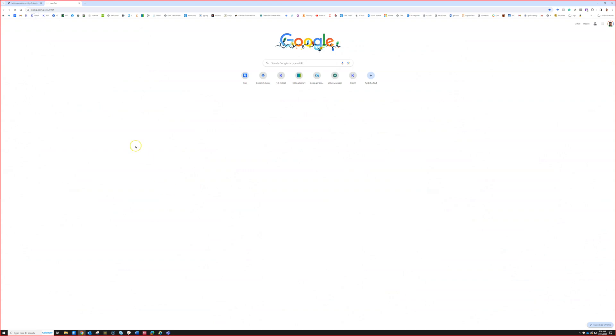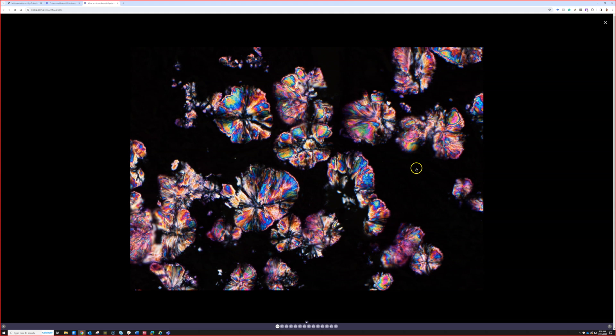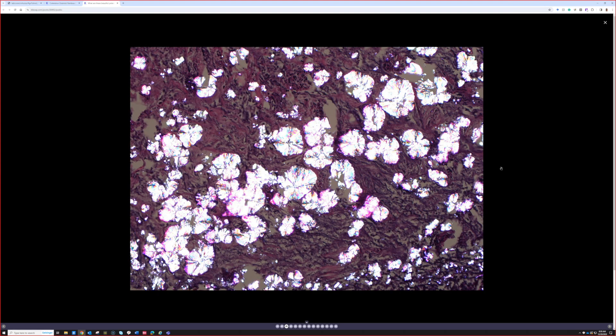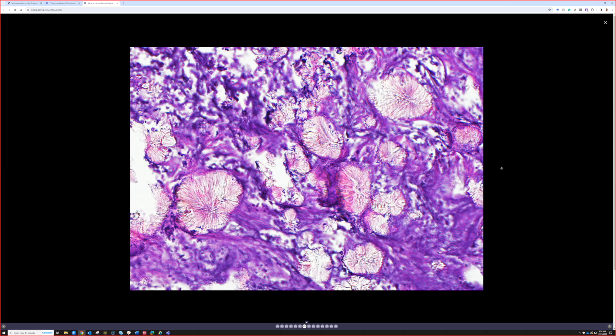I think I've got a better example here that you will enjoy. Look at that — it's amazing. They have kind of a floret-like appearance. I took many, many pictures; it's hard to get pictures of polarized light exam depending on how you adjust the light and the polarizer. That's what it looked like here on H&E — these radial arrays of chunky needle-shaped crystals.